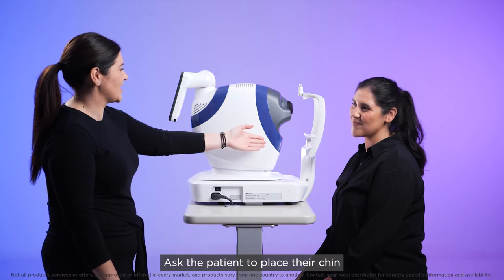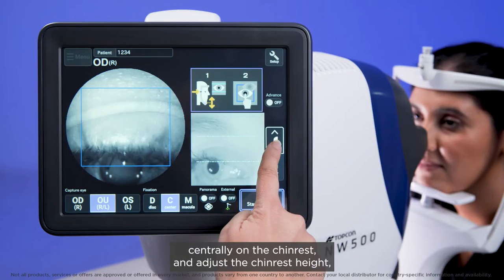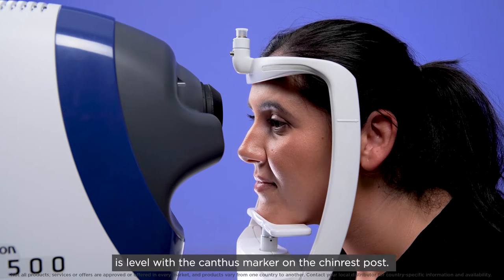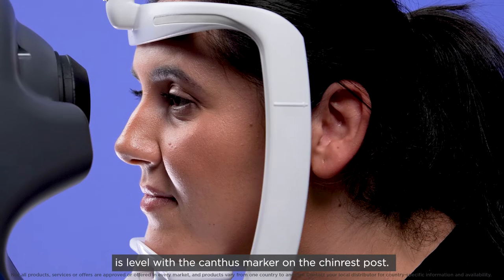Ask the patient to place their chin centrally on the chin rest and adjust the chin rest height so the outside corner of the patient's eye is level with the canthus marker on the chin rest post.